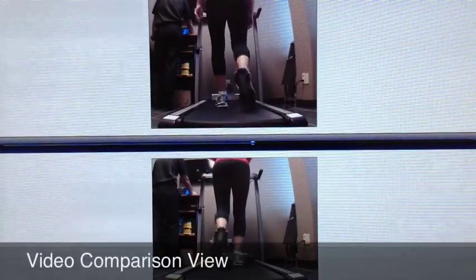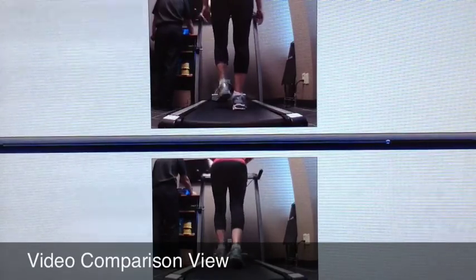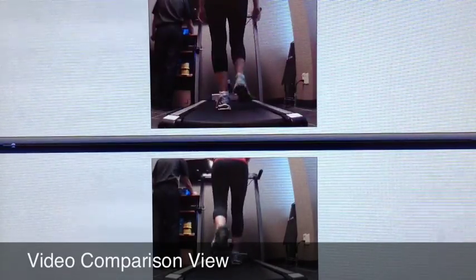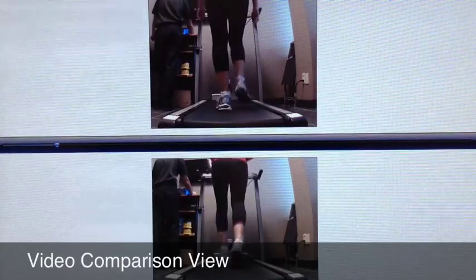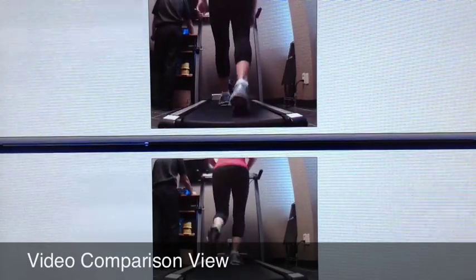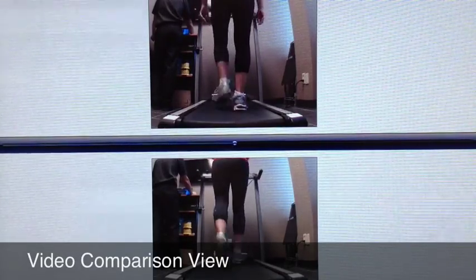Having the ability to compare two different scenarios can be quite invaluable. We have the ability to compare two different video sessions at the same time, like this patient both walking and running in the same pair of shoes.